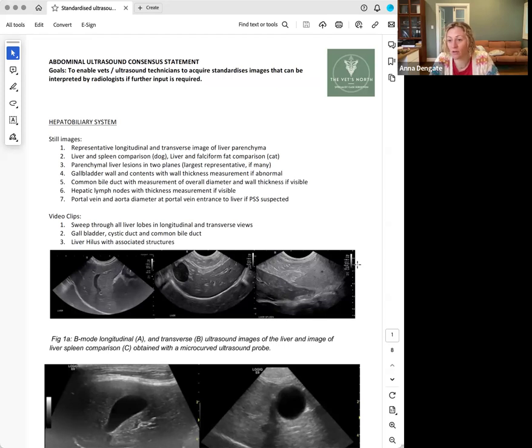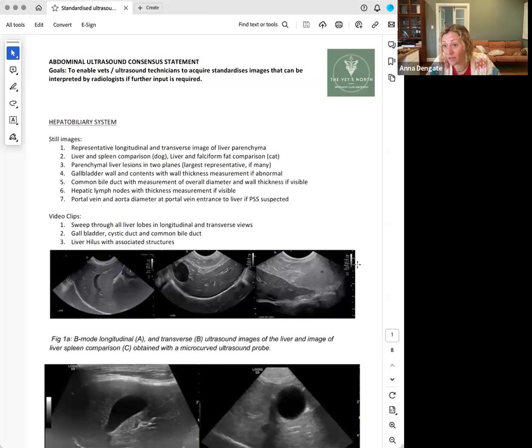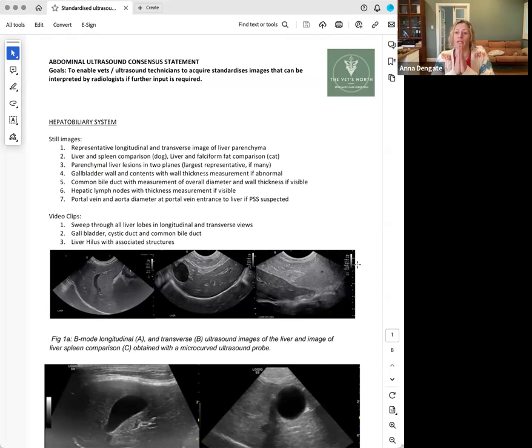What's one of the artifacts or complications that we get from measuring the cava? Volume status of the patient. Yes, volume status of the patient. Good. I missed what you said, Jane. Sedation and Domitor, is it? Yes. So if you slow down the heart rate with Domitor, for example, you get more time between beats. So you get more blood accumulating in the cava between the heart filling. So your cava is going to go woo, woo, woo, woo with every beat because venous return is slower.